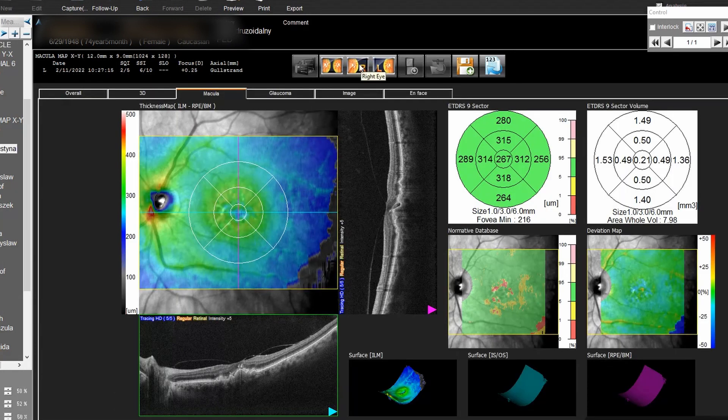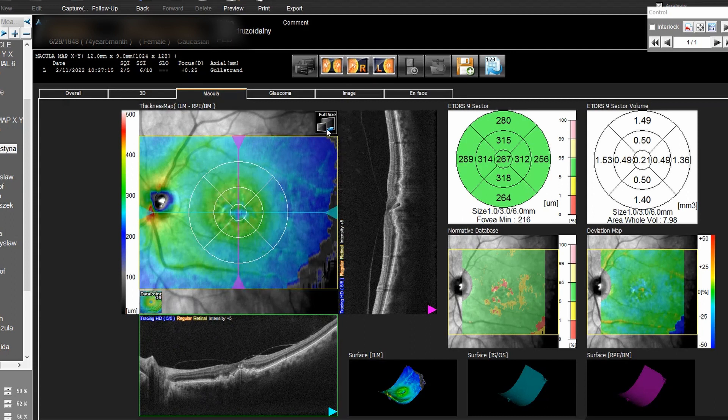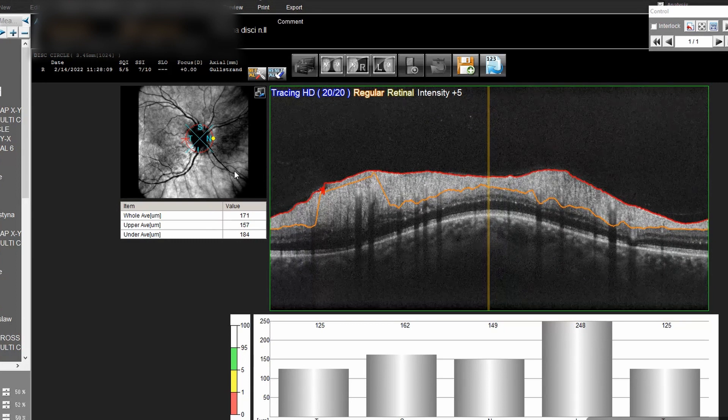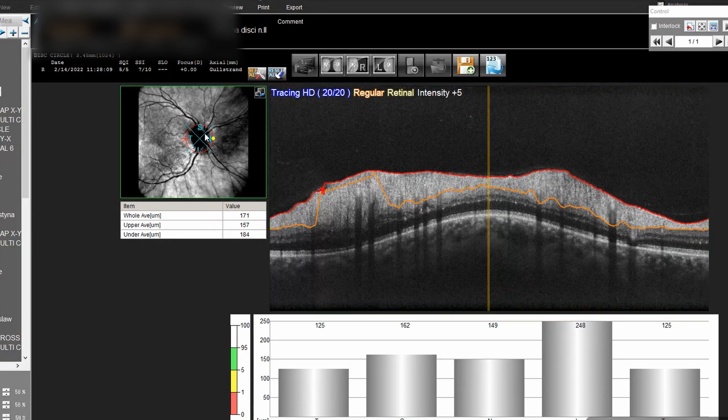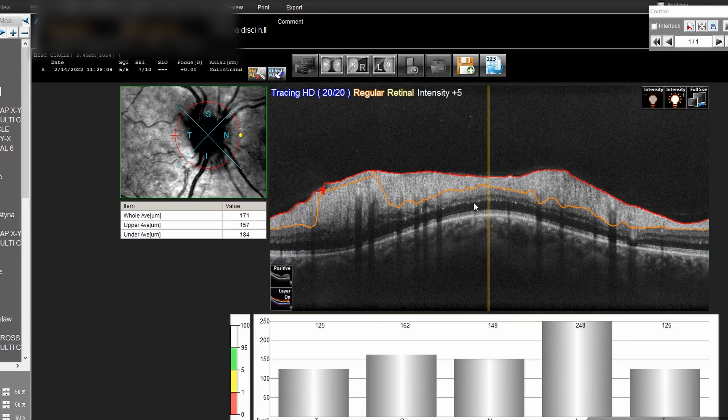Naturally all the images can be edited as you want. You can change the position of the fovea. Now it's time to see glaucoma.